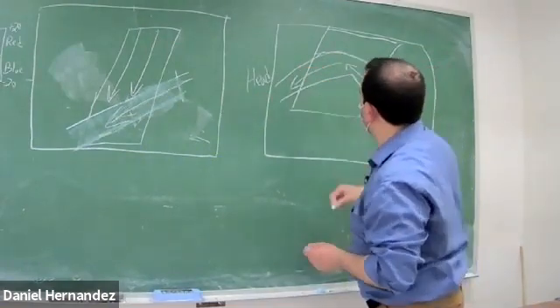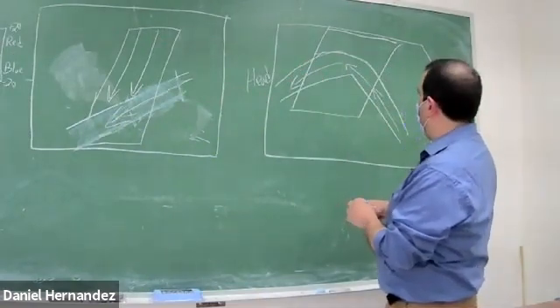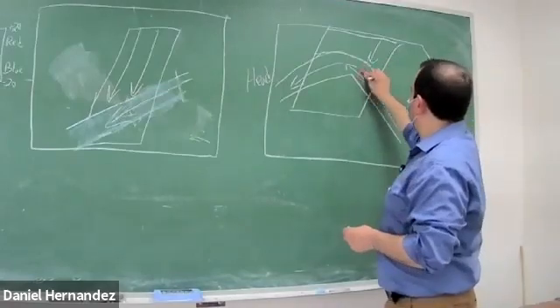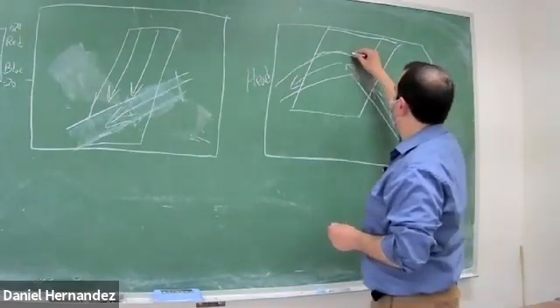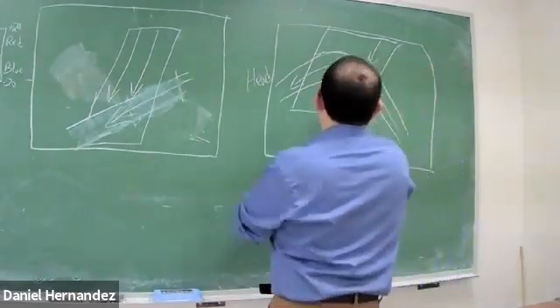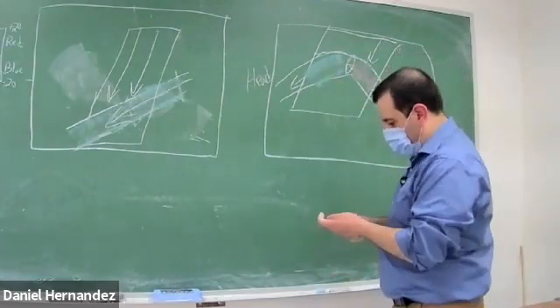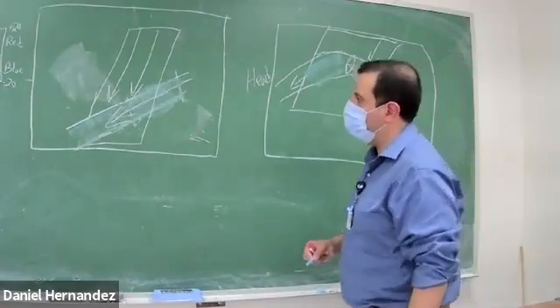If our ultrasound beam is coming down this way, our blood flow is coming up towards that beam, trying to meet it. So this segment will be red. Where we're perpendicular to that vessel, we'll have no color. That would appear black. Where the blood flow is then coming around that corner and running away from our ultrasound beam, we get the negative Doppler shift, which would be blue.